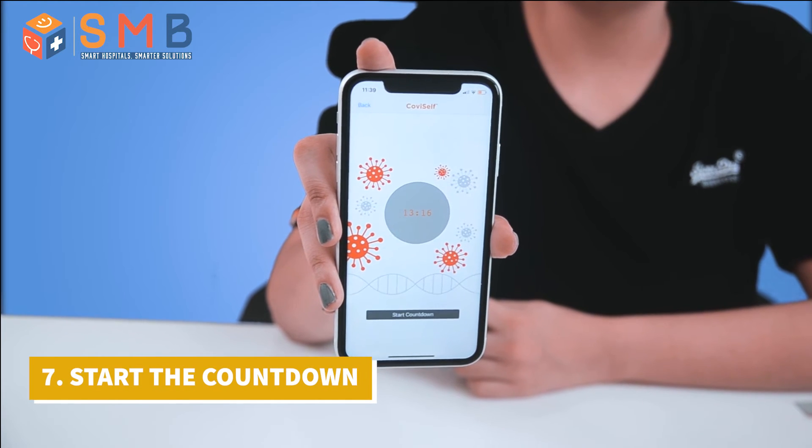Open the app and start the countdown. Any results coming up after 20 minutes are considered invalid. After 15 minutes, you would get a notification from the app saying that your report is ready. So you have to check the report then.